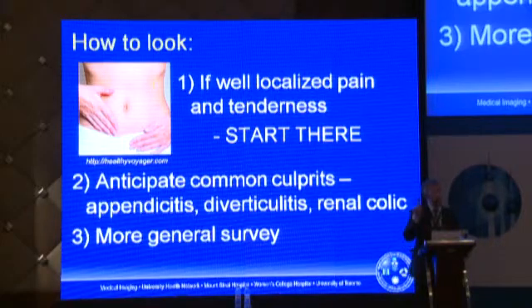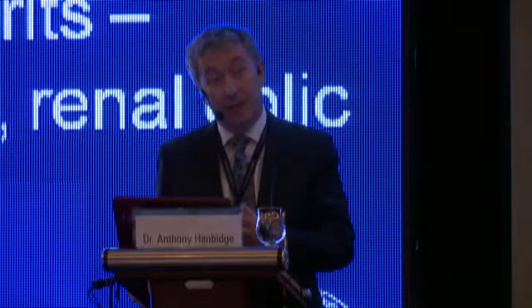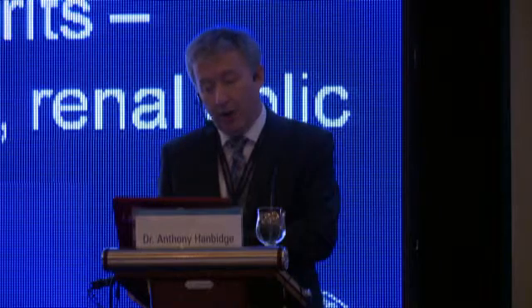So ask the patient, can you put your finger on the tender spot or where the pain is? The finger goes on, and I would follow that quickly with the probe. I know some physicians who actually give the patient the probe and say, can you put the probe on where you think the problem is? And they start there. If that doesn't solve the problem, then anticipate the common culprits: appendicitis, diverticulitis, and renal colic. And I've tried over the years to train myself to look for these things in some kind of time-efficient way, so that I'm not in there for half an hour or 20 minutes.